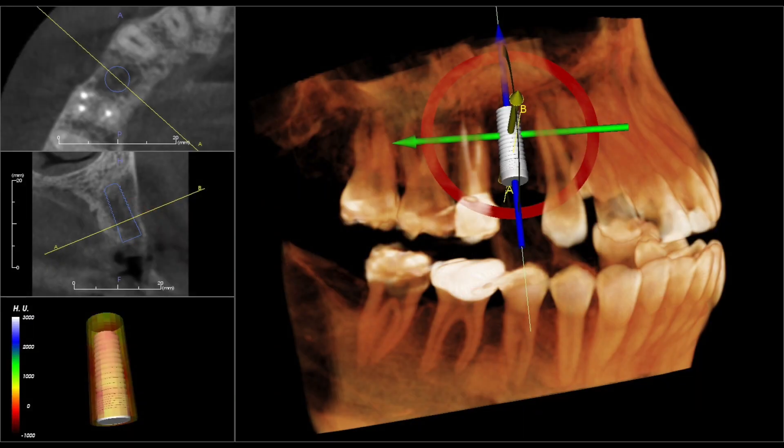On this case, what we'll notice is this patient needed an implant, or has a missing tooth, and would like to have an implant on tooth number five. But as we can see, the bone quality isn't quite dense enough.